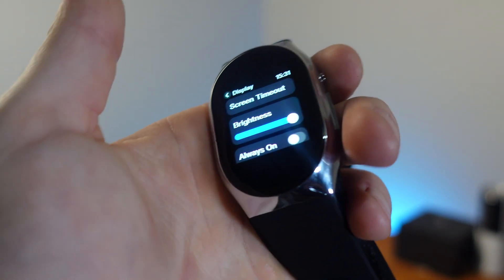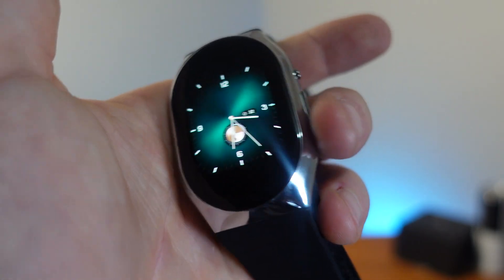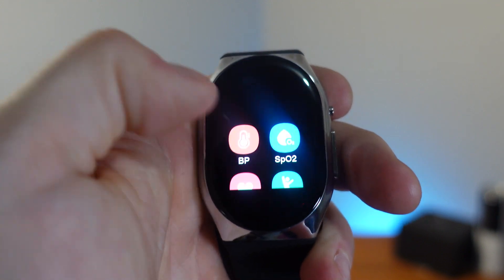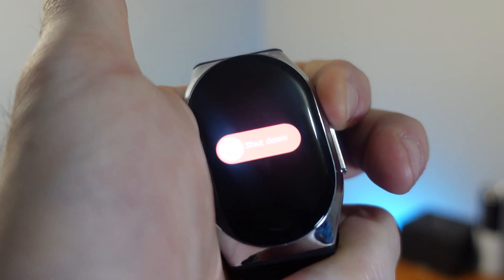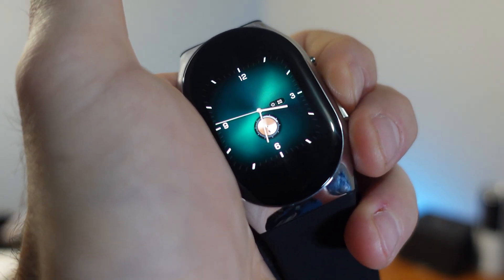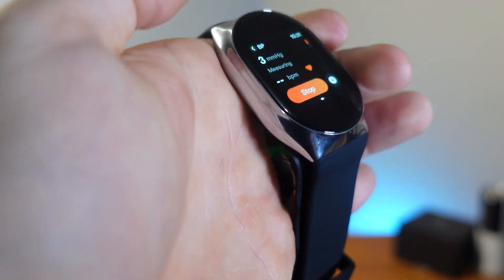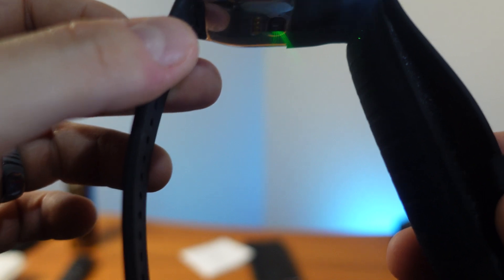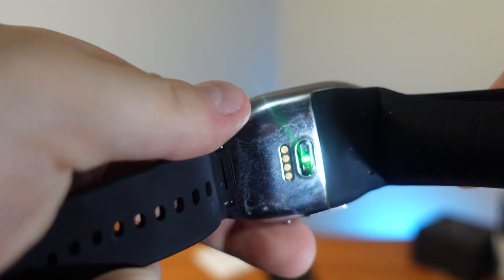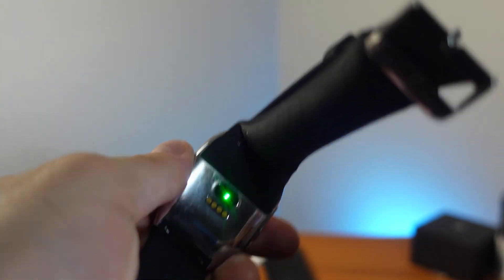In the settings you can turn on brightness, always-on display, and raise to wake. The top right button is your screen-off button. The big button brings you back home and also shows all your apps at a quick glance. Hold the top right button to power off the device, and hold the big button to go directly to heart rate measuring. You can see the little bladder fills up around your wrist — takes about 20 seconds. There's also an optical heart rate monitor on the bottom.